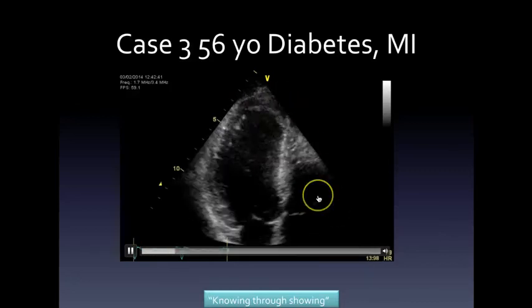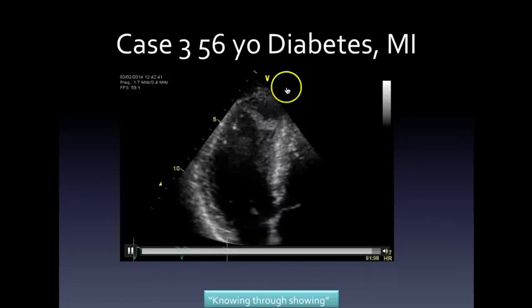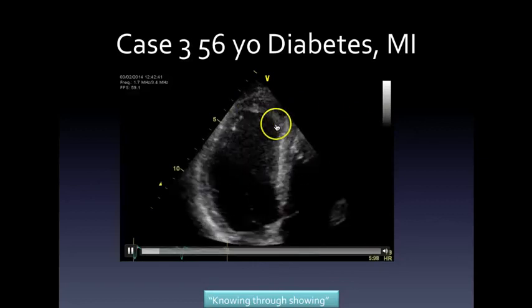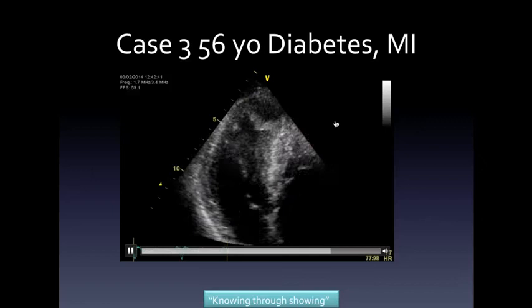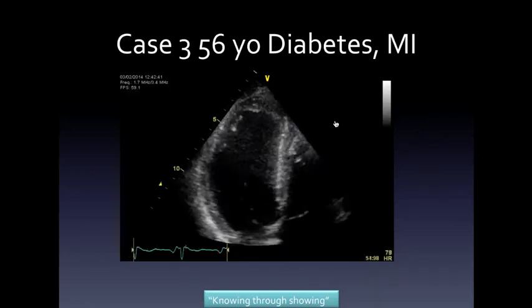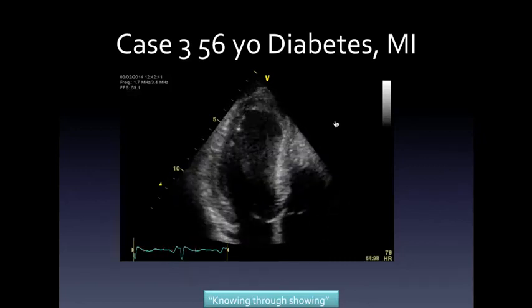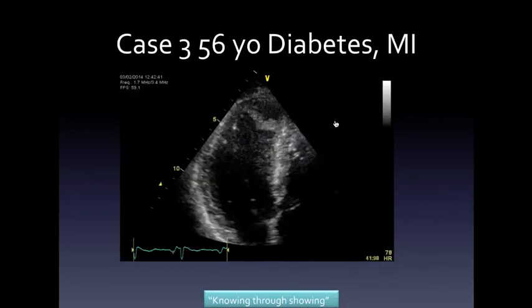I hear thrombus, I hear fluid. So the differential, firstly, let's look at the wall. This is a massive disconnected segment, but this isn't the wall. As Francis says, is it the wall or is it thrombus? We think it's thrombus, we hope it's thrombus. Because the alternative is rupture. So you have a patient sitting calmly waiting for his breakfast or his lunch or his dinner, sitting there quietly, and you know that at any moment he could expire. So it causes tachycardia in the team, shall we say.